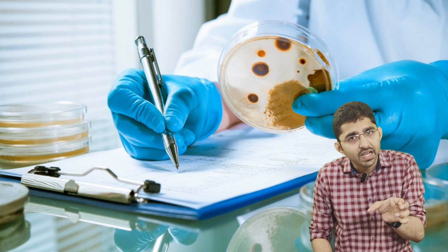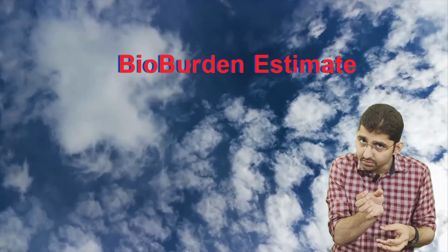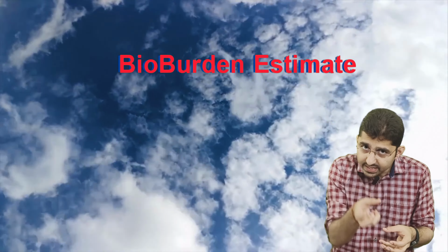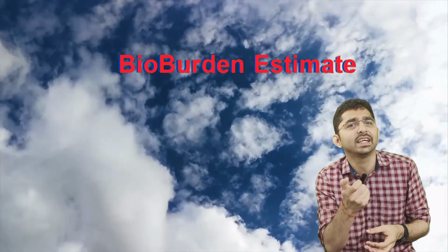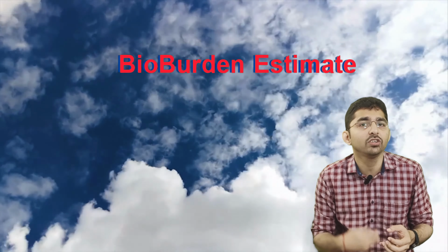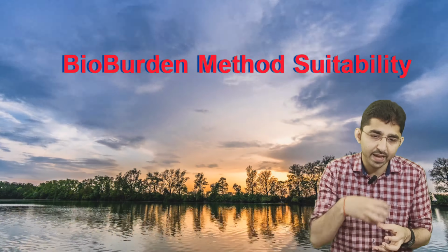Fourth one is the bioburden estimate. A value representing the bioburden, after applying the bioburden correction factor, is called a bioburden estimate. I mean the amount of viable microorganisms present on that product. Fifth one is bioburden method suitability. Sixth is the bioburden spike.